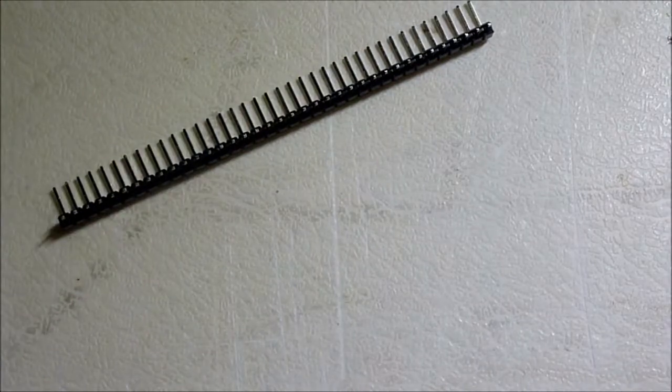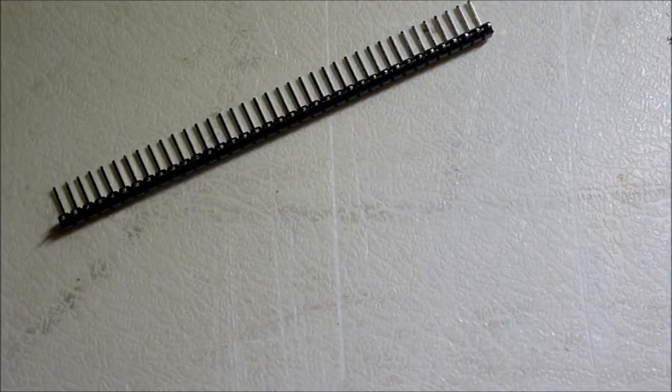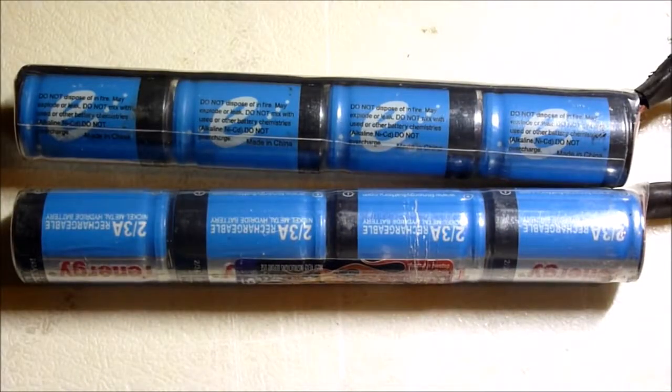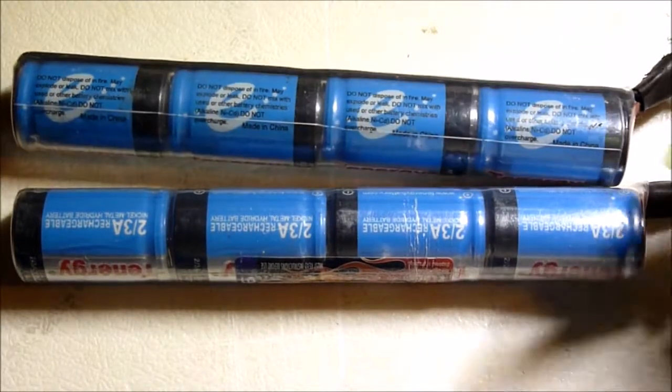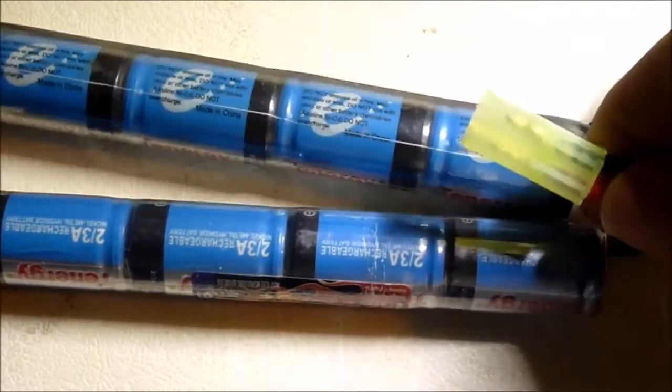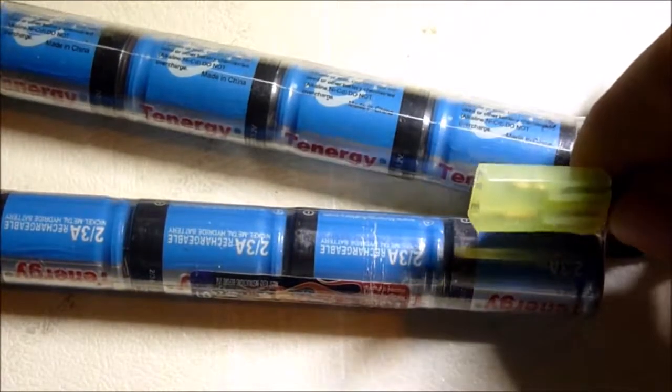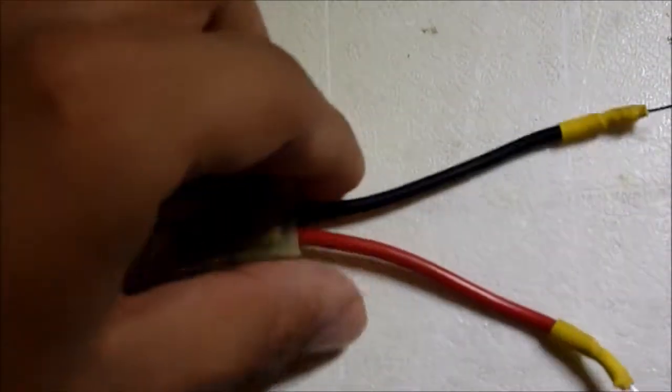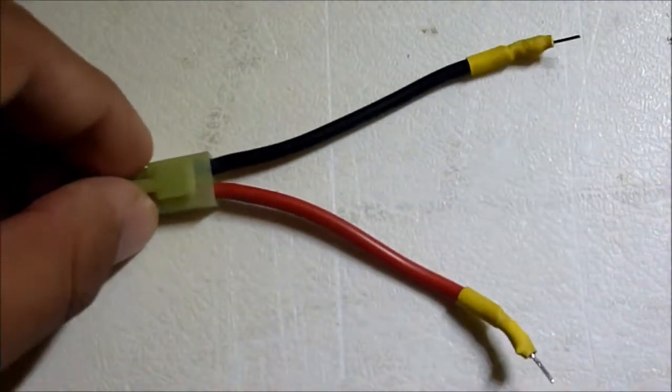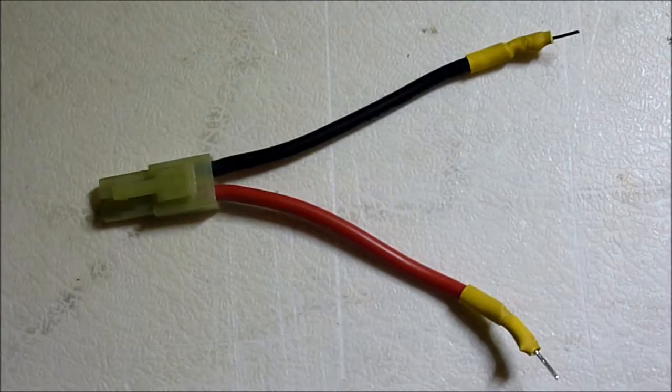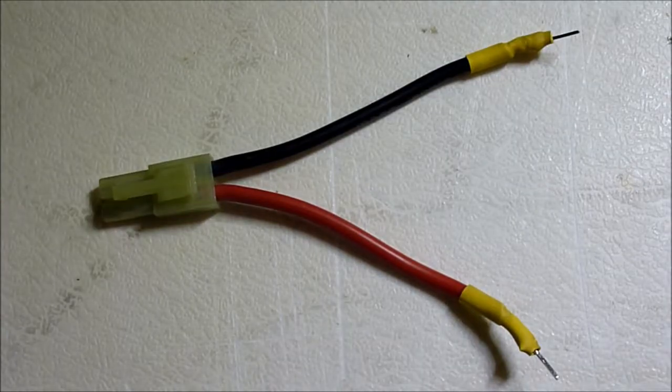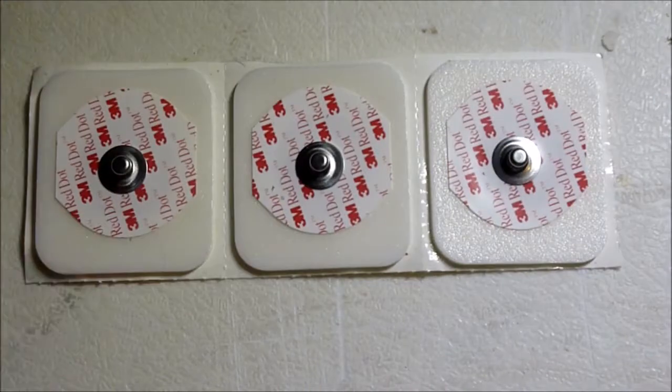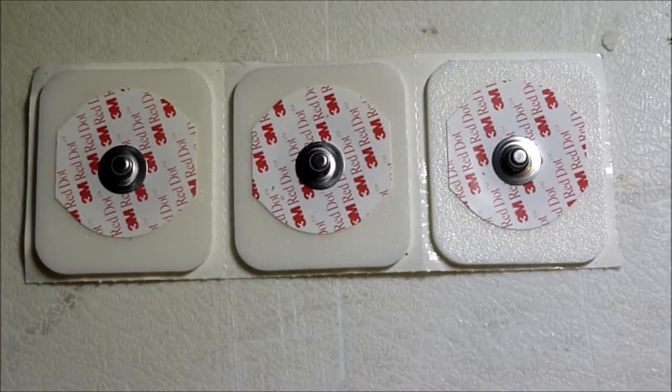I'll also need angled header pins, a 9.6-volt butterfly-type battery with a small-type Tamiya connector, an adapter to attach my battery to the board, and three electrodes.